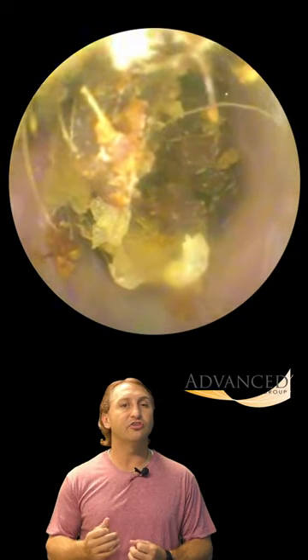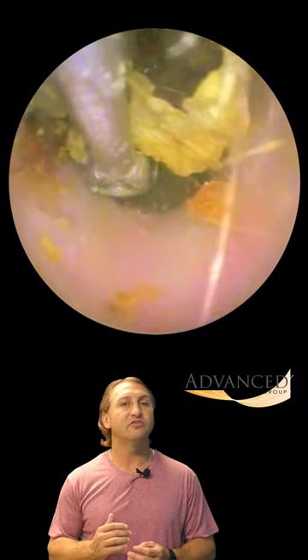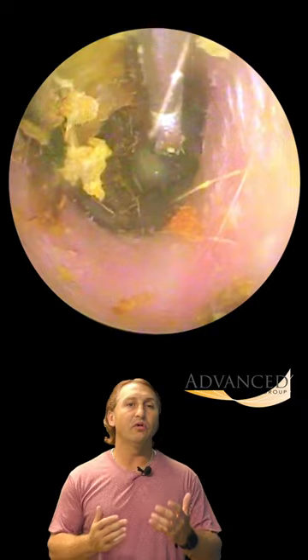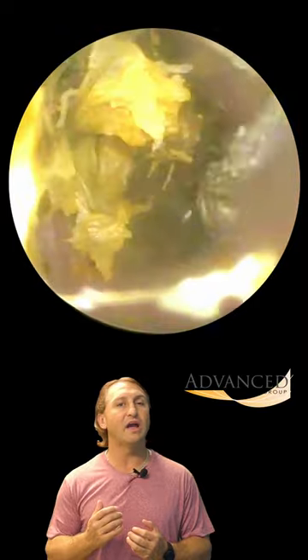So we're going to first use the curette to try to pick this wax up and at least give us a little view of the eardrum. You can see as we lift it up, we get a little peek at the eardrum right there, right below the curette. So now we're going to switch to a more angled version in order to use that angle to help to pull the earwax out.